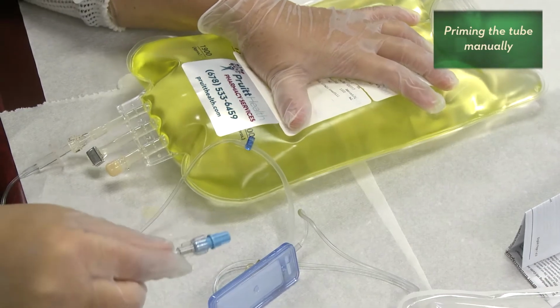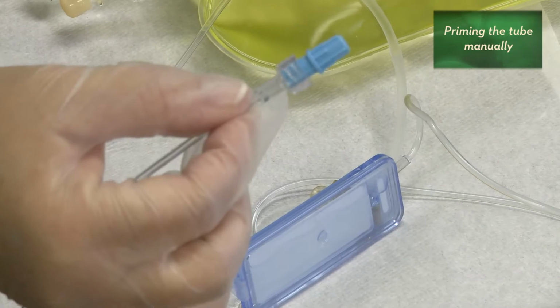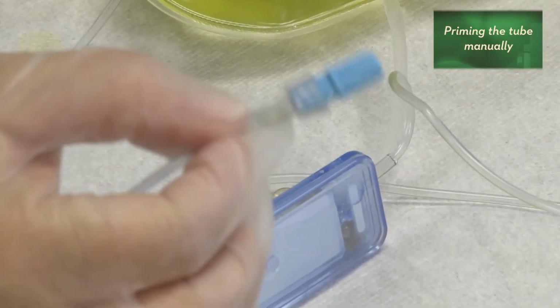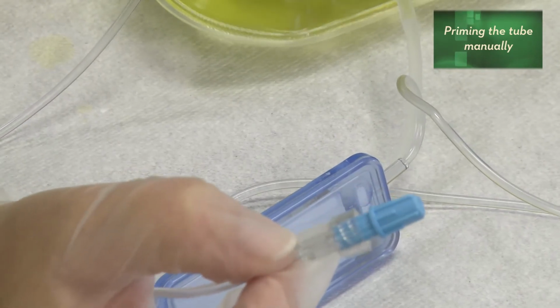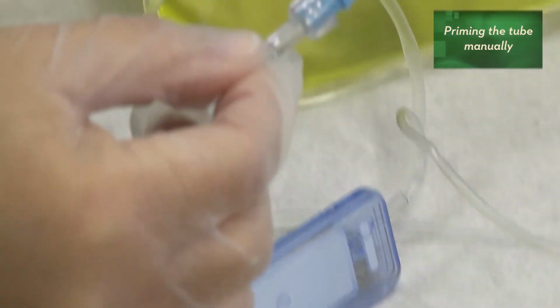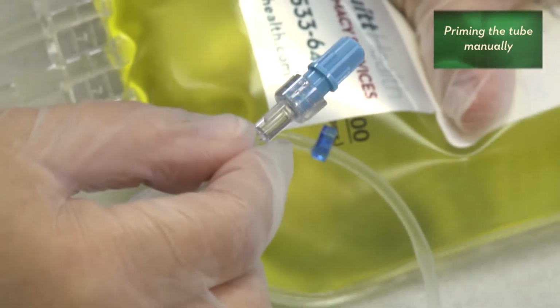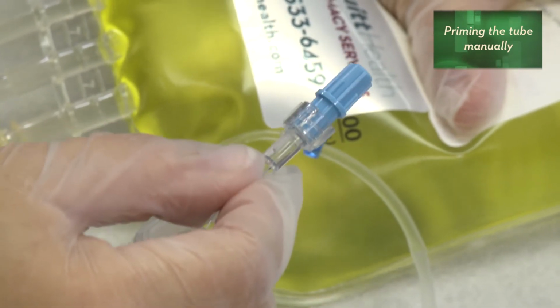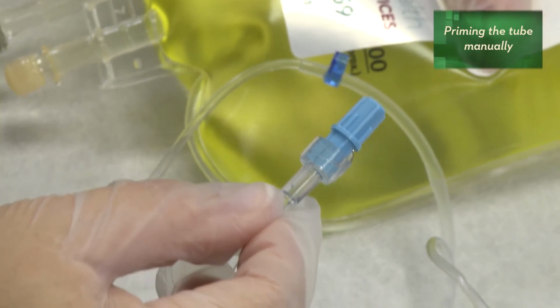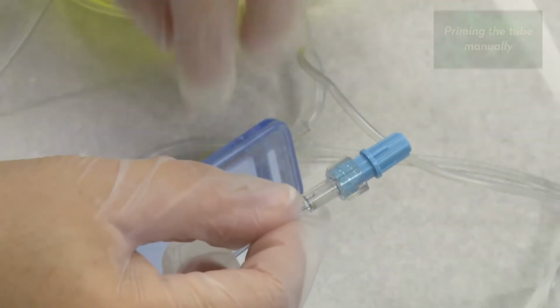Now I'm going to wait and watch it drip off the end of the tubing now that it's gone through the filter, and I'm leaving that blue cap on. It'll still drip around it, and I'm keeping the end nice and clean and sterile while I wait for that drip. And I'm pushing on the bag. You can see it moving. There's the drop. All right, we're at the end. I'm going to stop pushing on the bag.